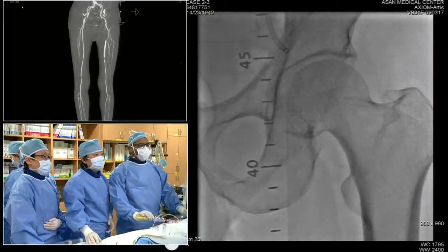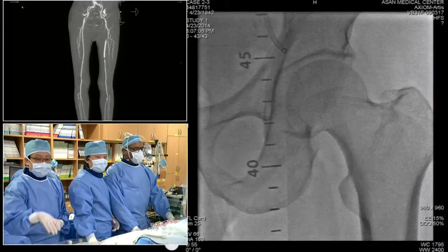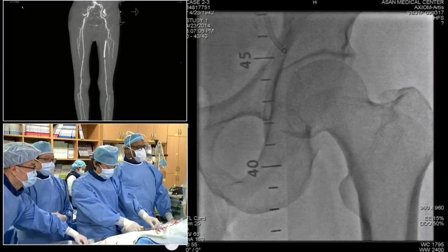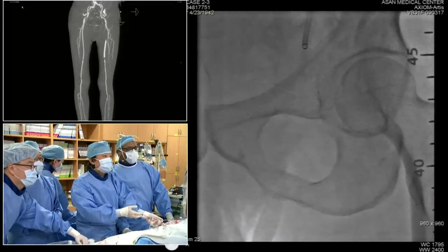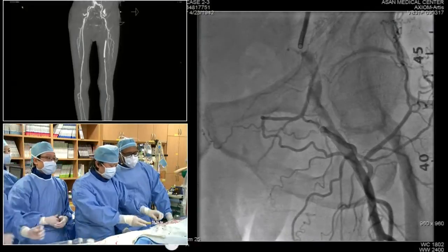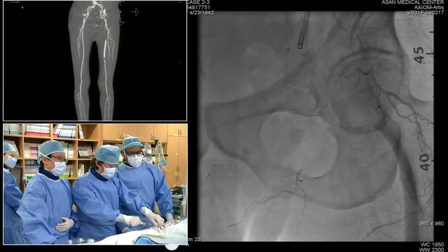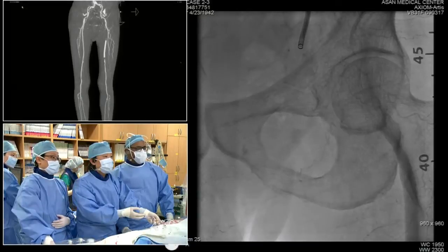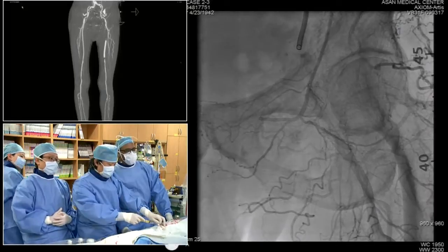So what we're going to do here is, if you can give me an LAO on the patient, please, like a 20 LAO. I'm going to take an angiogram, and we're going to identify this nipple here. Be careful. A little puff. Okay, we're going to take this angiogram. Go ahead. Wait. So this is actually some favorable anatomy. Puff, go ahead. And it will allow us, with the sheath, some backup.